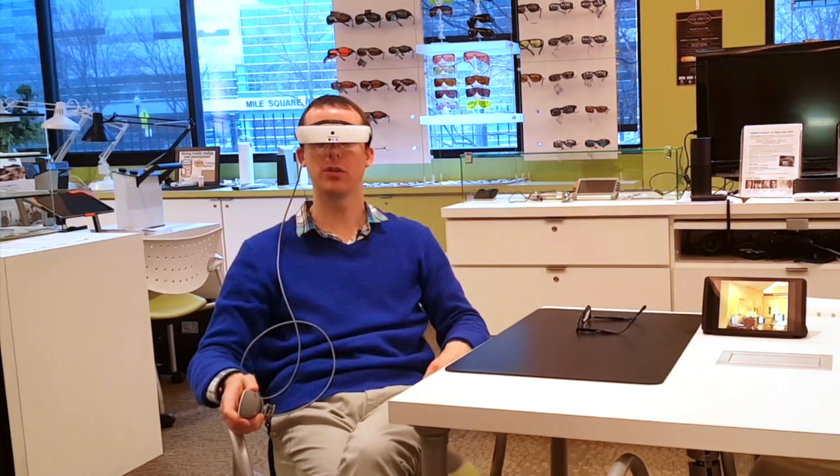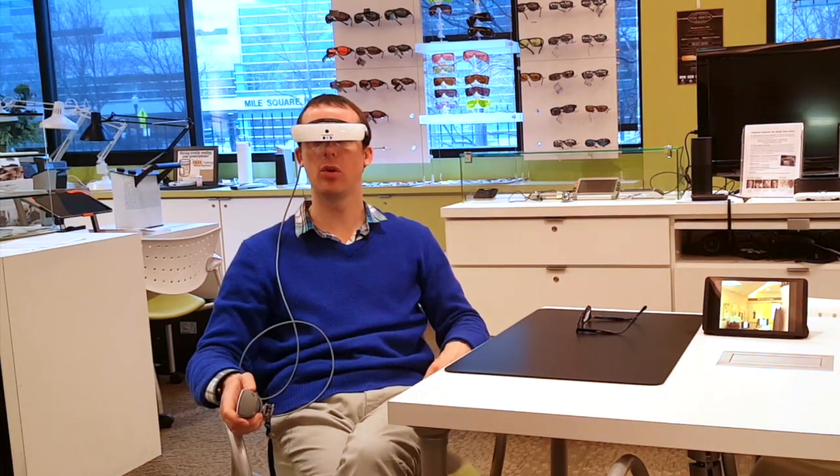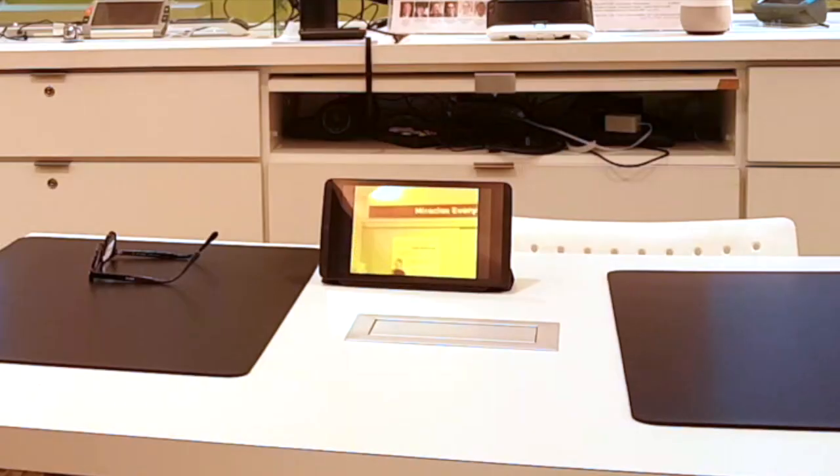Let's go ahead and look at something and magnify it. I'm going to look at this sign on the back wall of our store and start to magnify it. The device actually tells me as I magnify what magnification level I'm on. I've magnified to around 6x and I can read the sign on the back wall — that's fantastic.